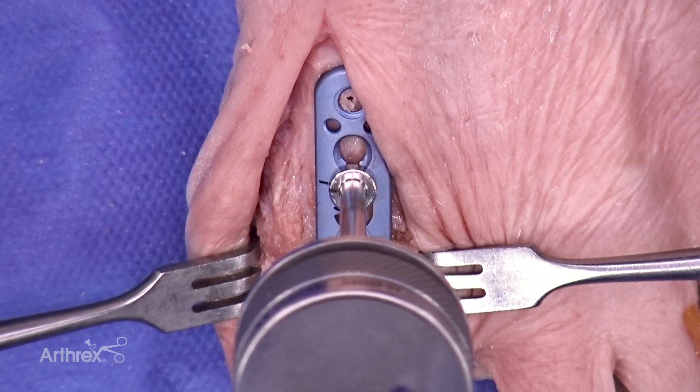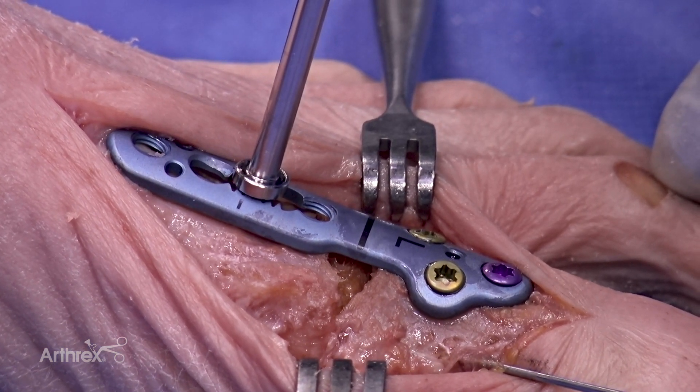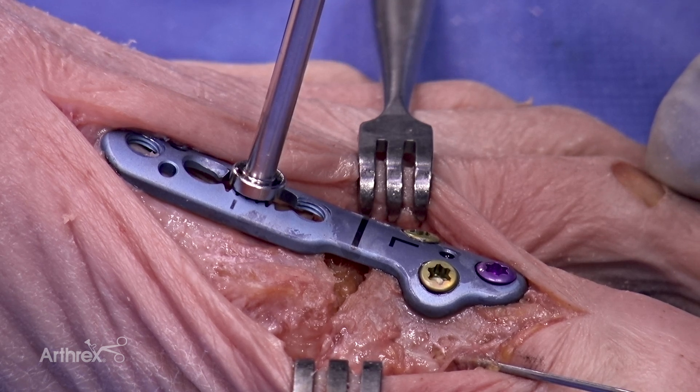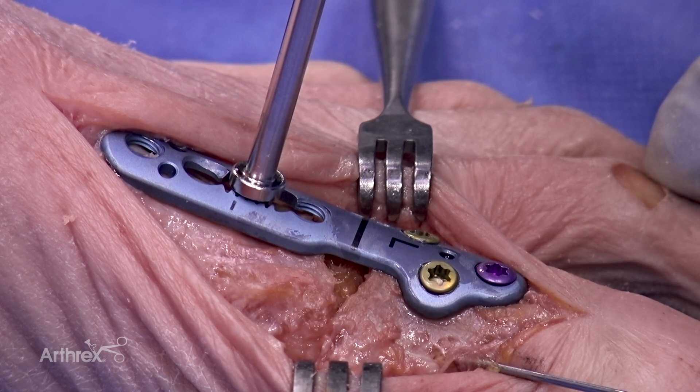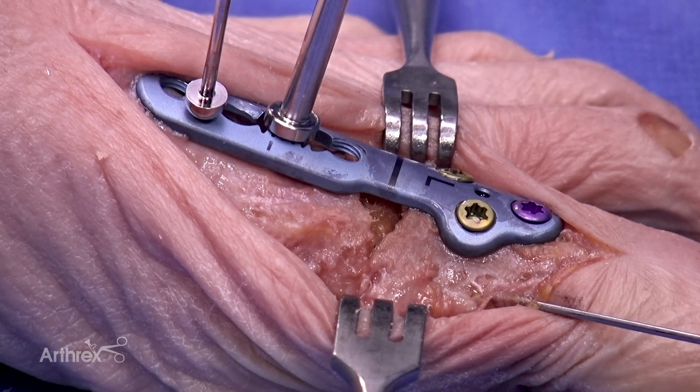Be sure to fully seat the compression device against the plate utilizing two-finger tightness. Turn clockwise until a positive stop is felt and do not tighten greater than that. Here's a nice endpoint with the geared compression. Once compression is engaged, fix the plate with the BB-TAC to hold the initial compression. The nice compression noted here is achieved with clockwise rotation of the geared mechanism.